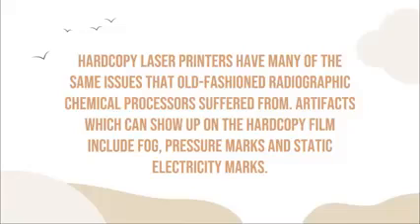If the film conveyor system malfunctions, image distortion, abnormal shading, or uneven scan line distribution can result. Okay, so image distortion, di ba, ma-distort ang image, mudako ang, for example, ang mga long bones, ma-shorten, ang mga skull, ma-shorten. Okay, abnormal shading, that means ma-increase ang iyang contrast or ma-decrease ang iyang contrast. And for scan line distribution, ako yung image na ipakita for the next slide.